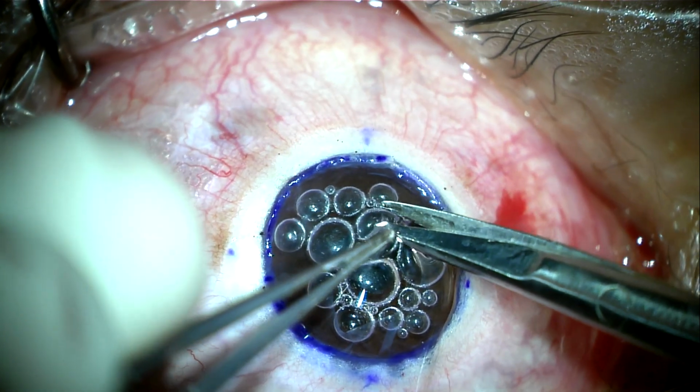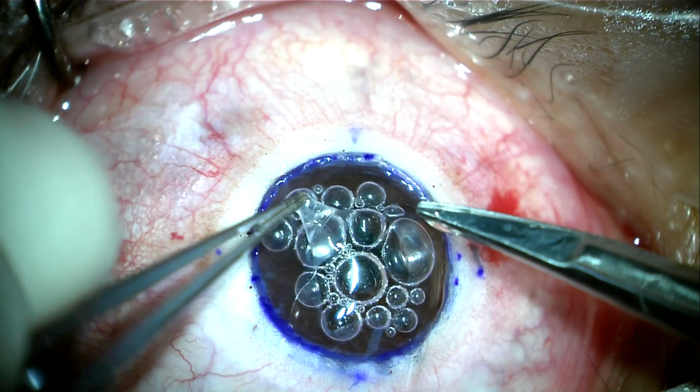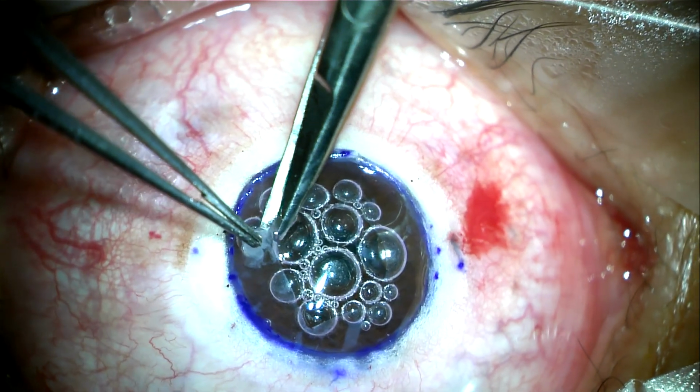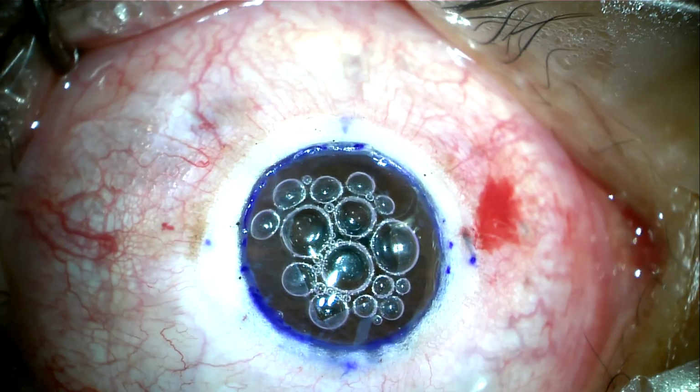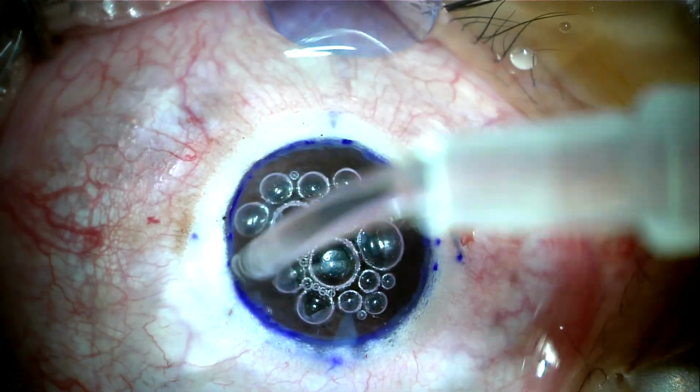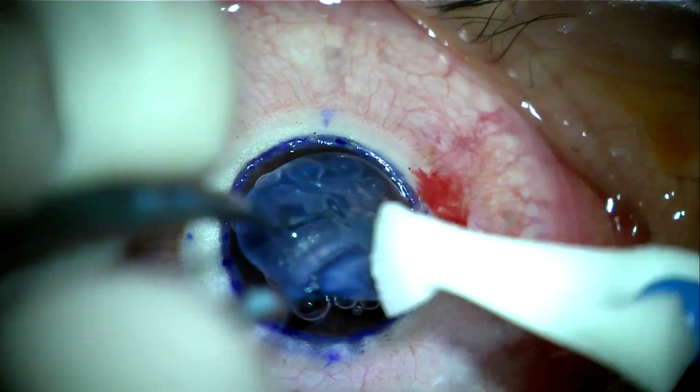Irrigation of viscoelastic is then done carefully, avoiding direct irrigation of the central bare Descemet membrane. And finally, placing a graft after removing Descemet membrane and suturing it with the usual suturing technique.